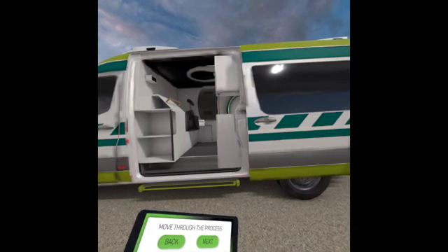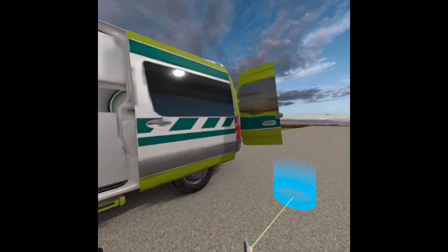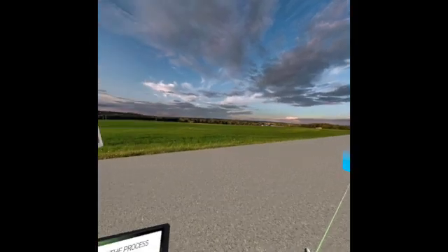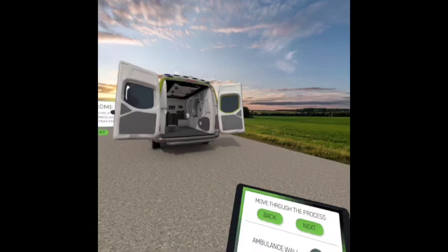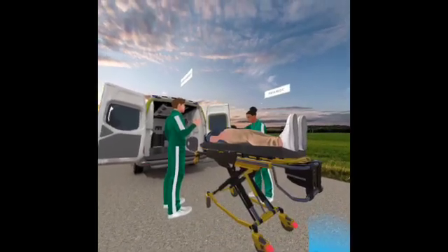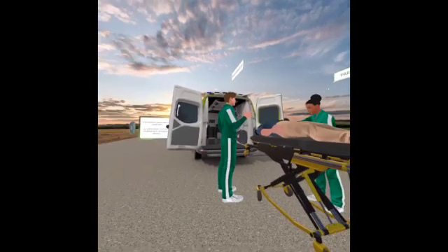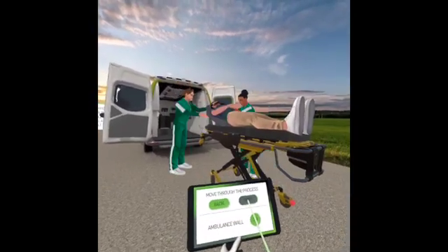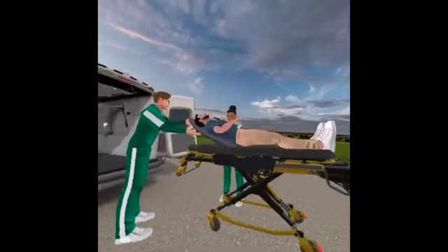Welcome to the Micro XCT scanner ambulance demonstration. The patient is loaded onto the stretcher and the paramedics remove all accessories that could interfere with the scan. The paramedics work together to position the positioning aid device underneath the patient's upper body.